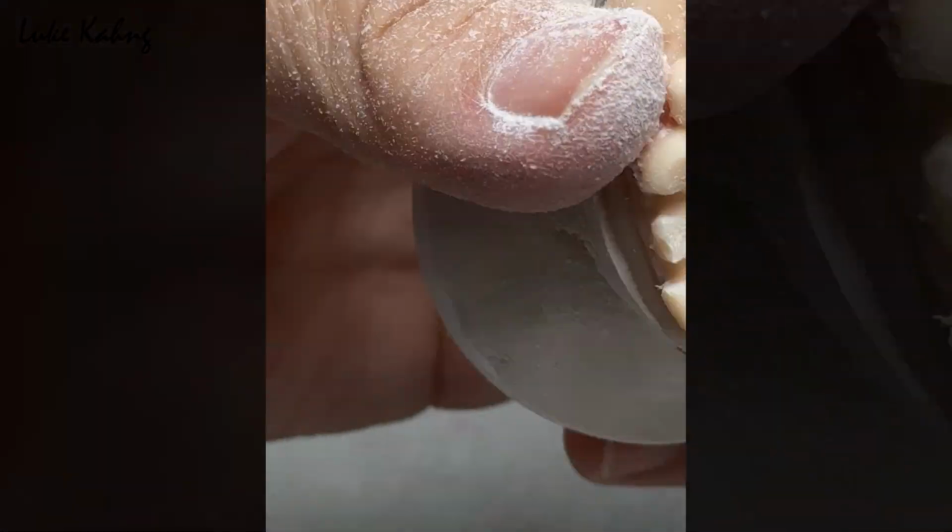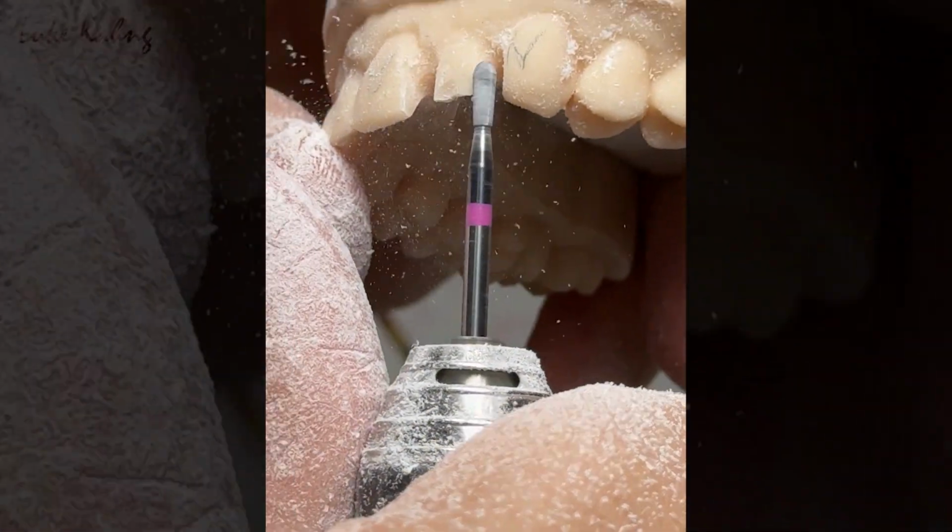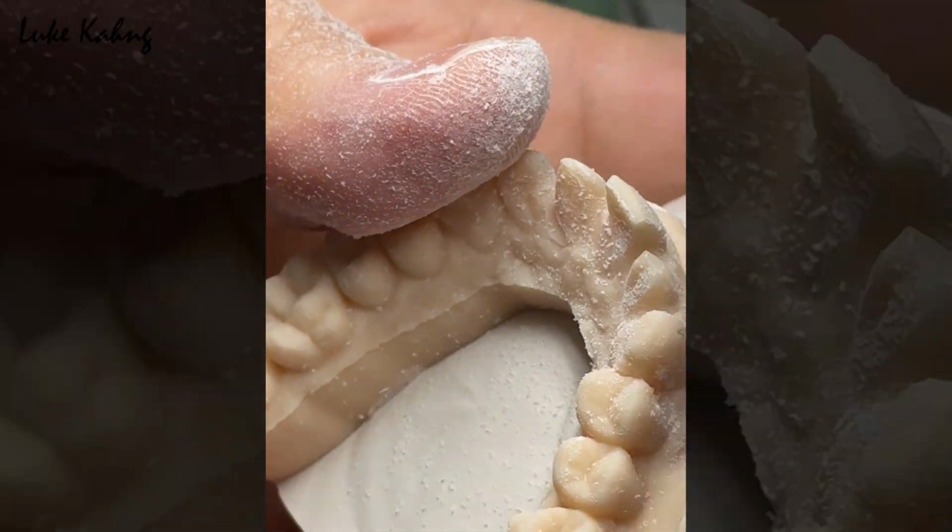Okay, this is a lateral cut. Of course, you can make a little bit more.